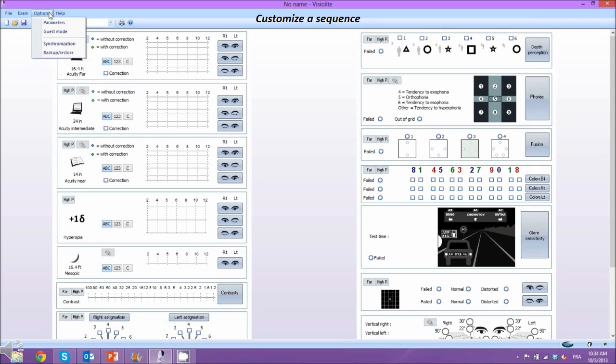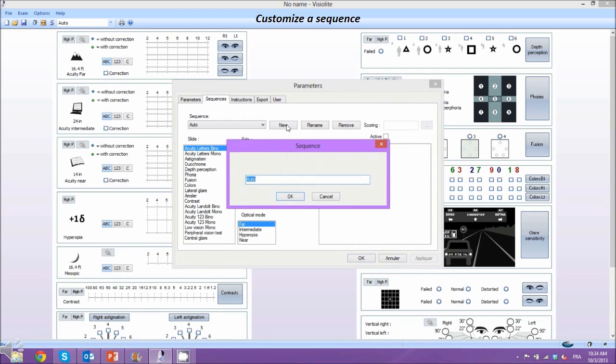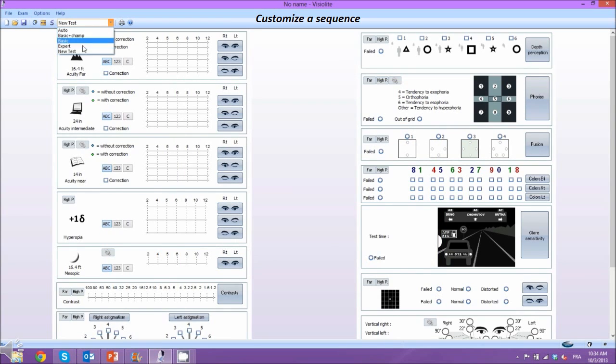Tests and sequences can be customised with ease. Simply click Option, then Sequences. New sequences are created by entering a name and adding the tests you desire. Distance and luminosity can be parametred for each test. The order of tests can also be chosen. Access your new sequence by clicking on the top window.